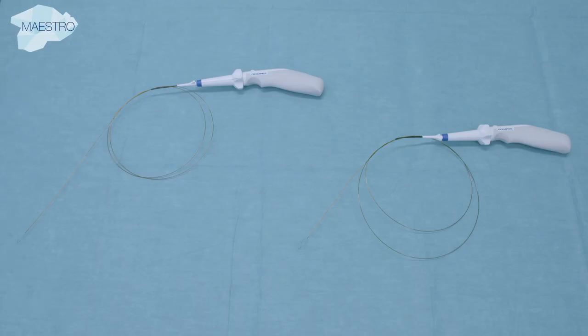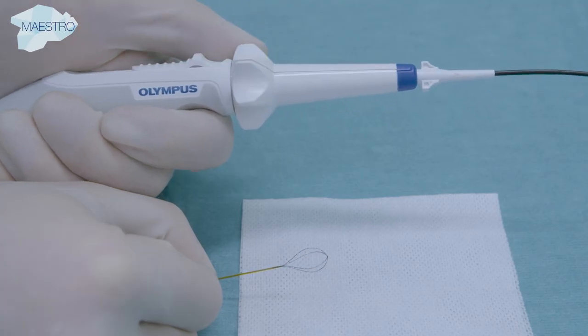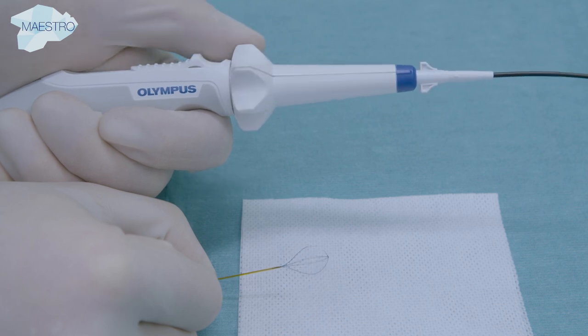A wide variety of stone baskets and graspers are currently available for flexible ureteroscopy. The most standardized basket is a 1.8 French 4-wire, no-tip nitinol basket. Nitinol is atraumatic for the renal cavities and the working channel of the endoscope. It is very soft and has excellent shape memory due to its super-elasticity.